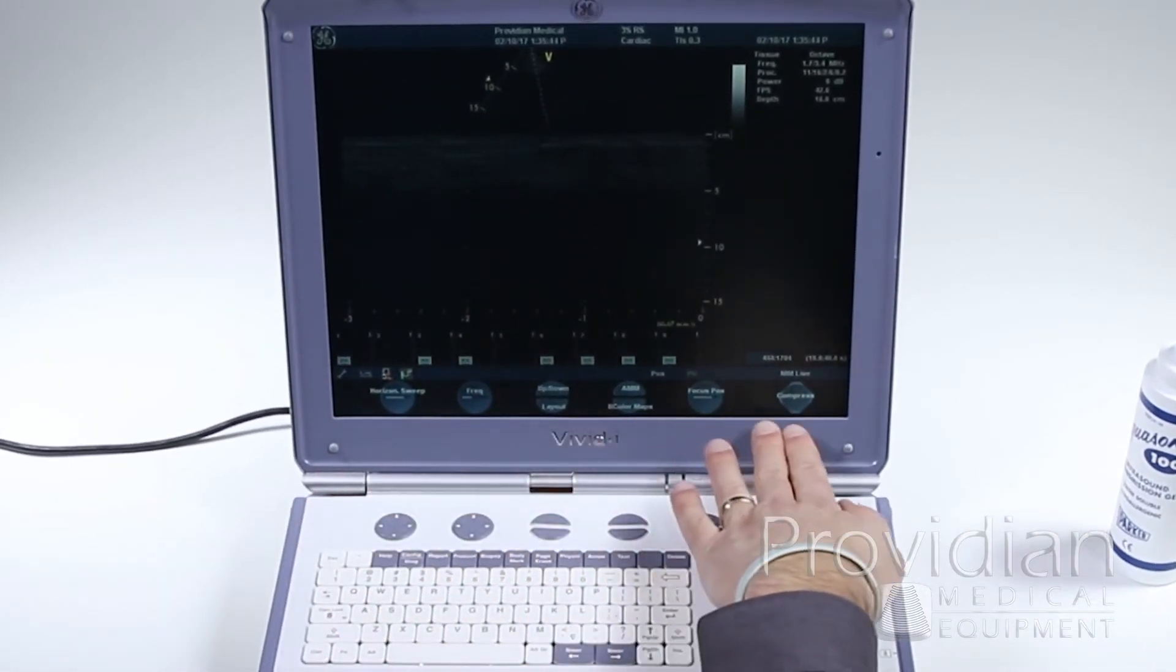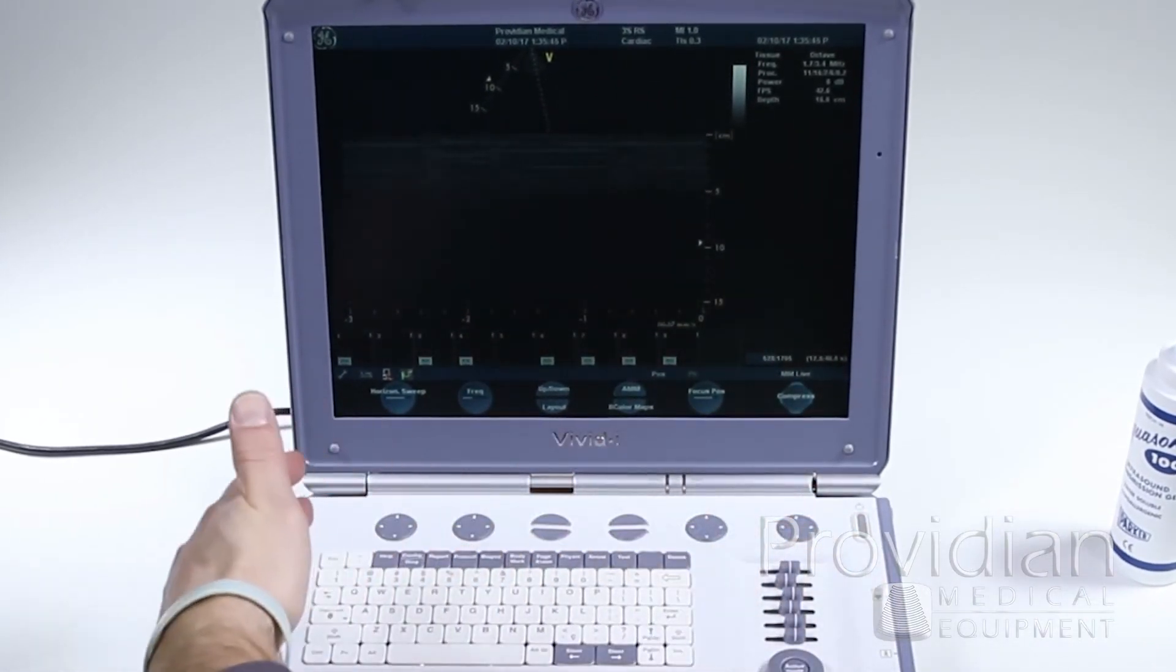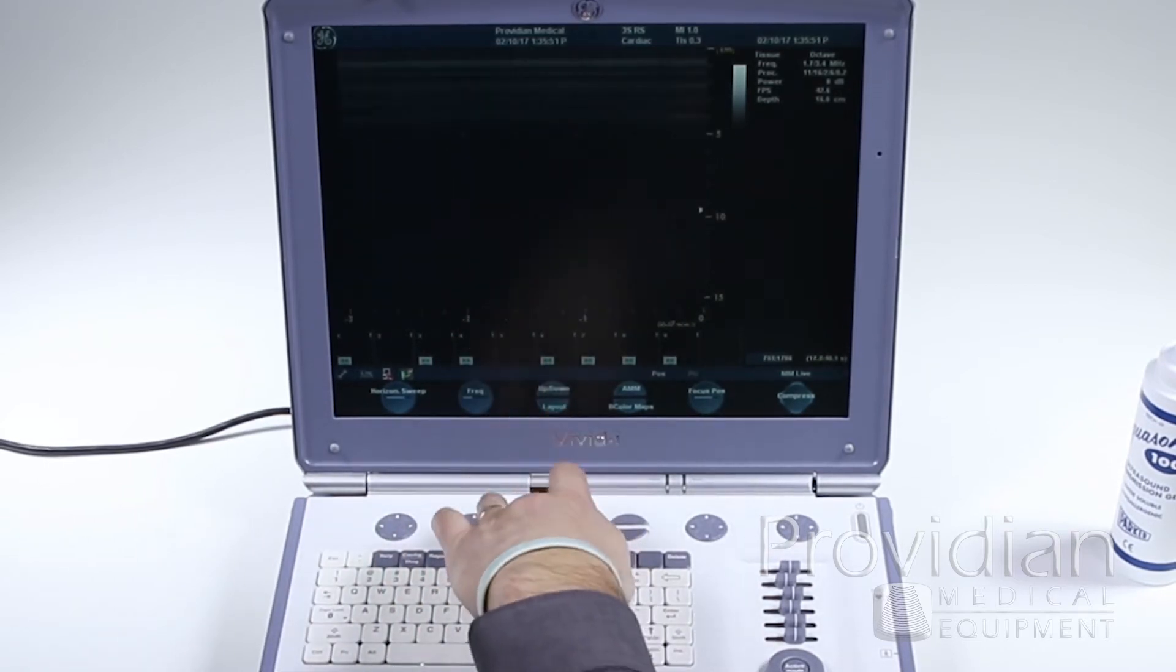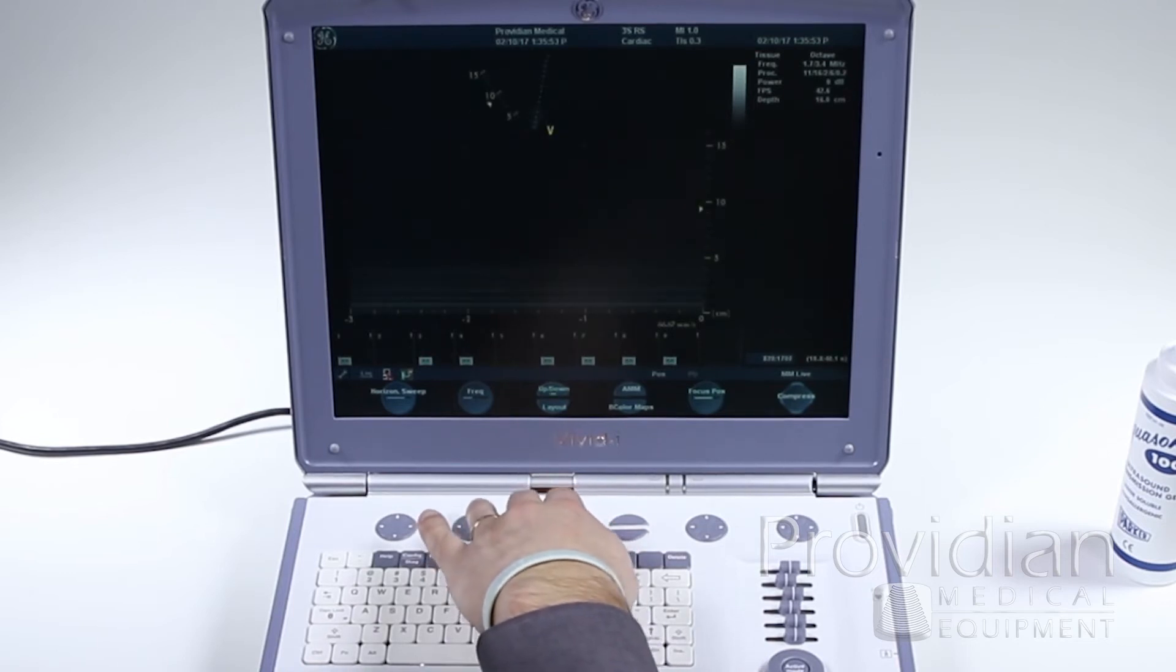Again, you have the same kind of image optimizations down here for sweep, frequency, the overall layout, how you want it to be seen, left and right. Switch it from top to bottom.